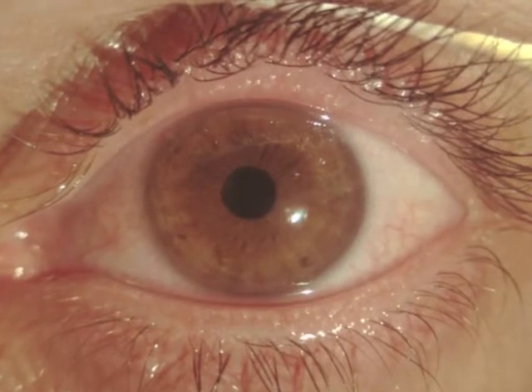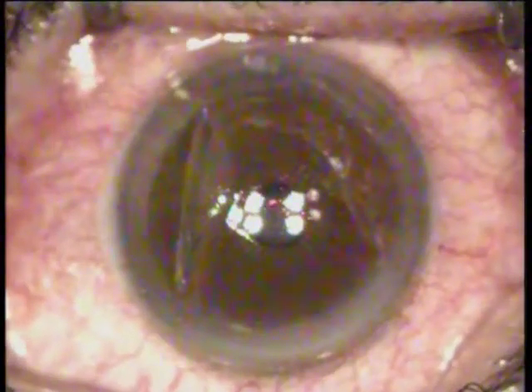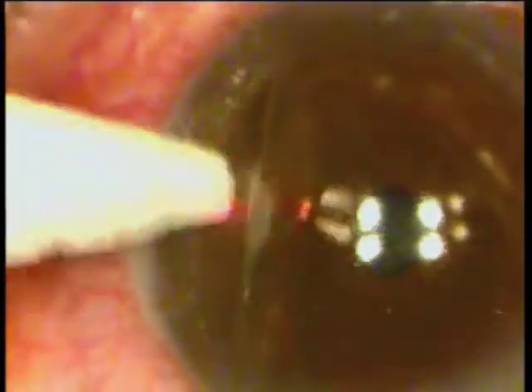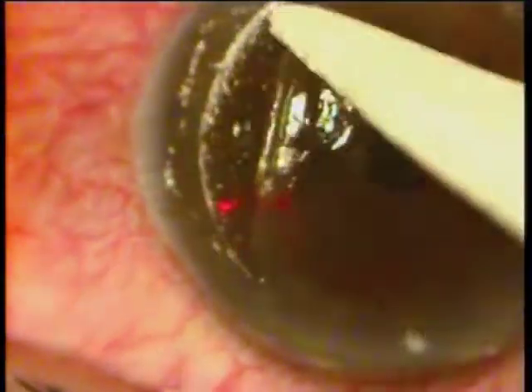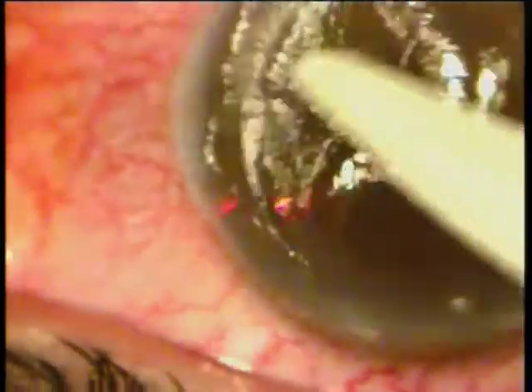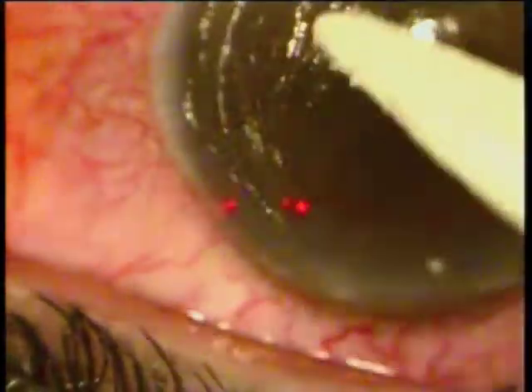Very challenging case. I hope you found this interesting. This is a similar second case — an older hyperopic LASIK patient of mine who sustained a serious tree branch injury. You can see a corneal incision on his left eye at the three o'clock position that has folded the flap — fortunately not the entire LASIK flap. It's been a few days, so the flap has epithelialized on its underside and over the exposed stroma.